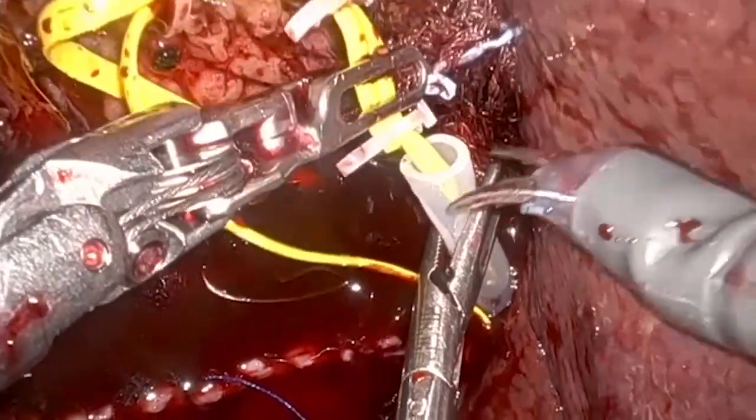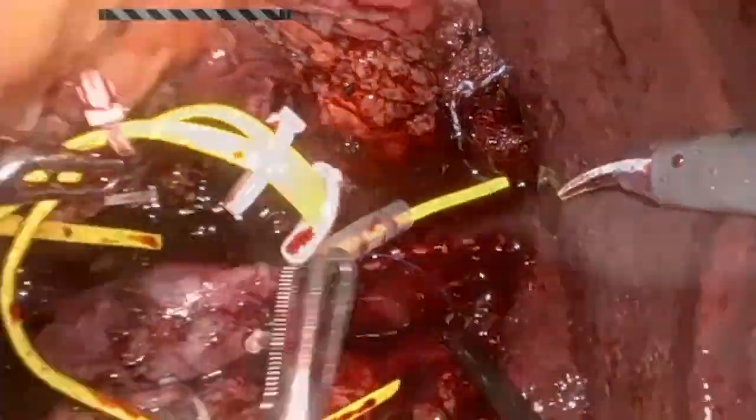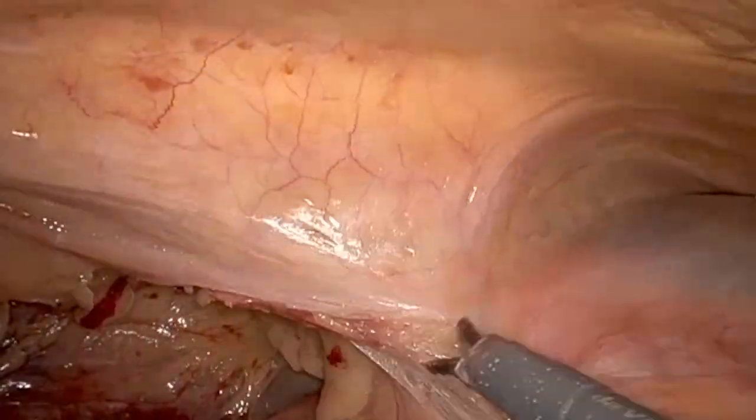After verifying correct hemostasis, the nephrectomy was completed and the surgical specimen was removed.